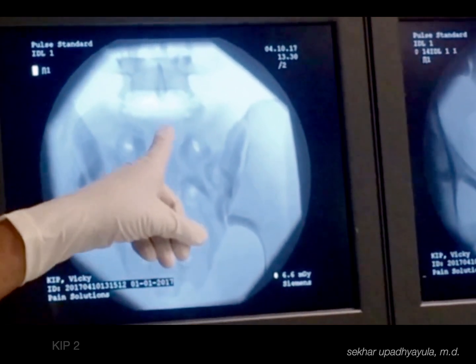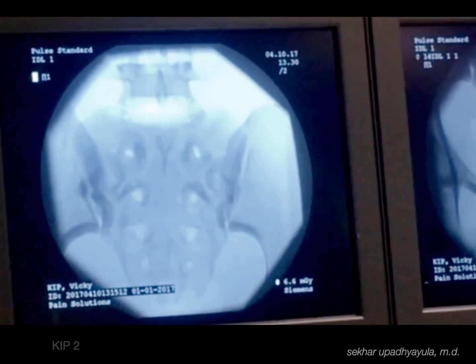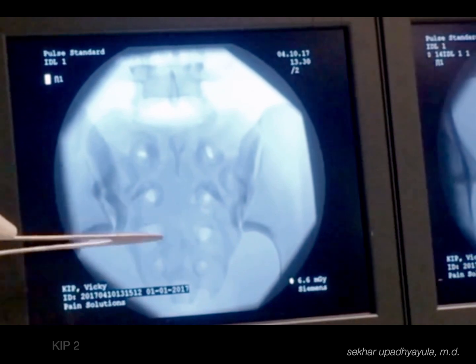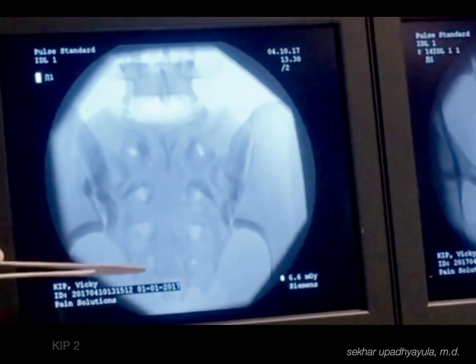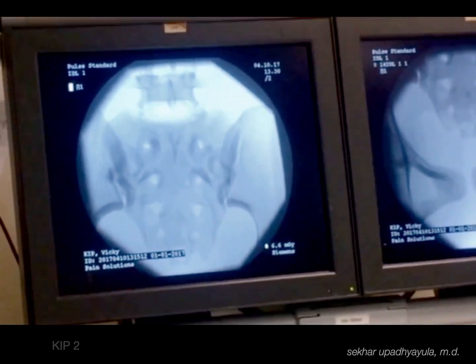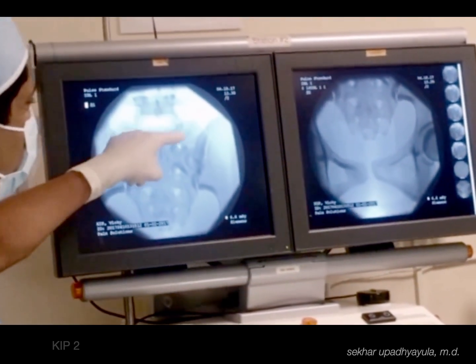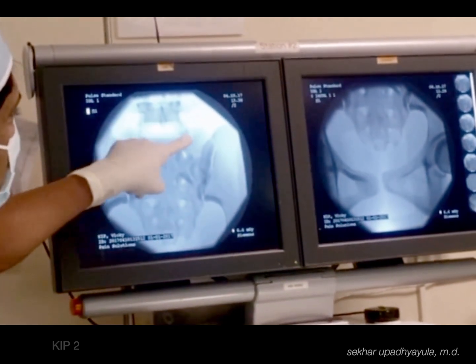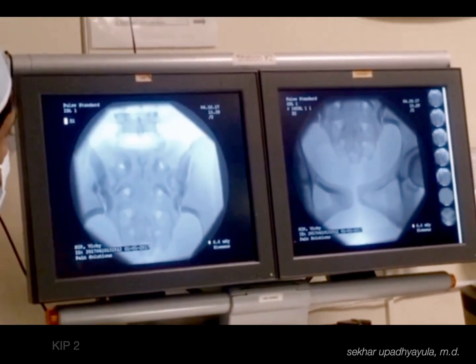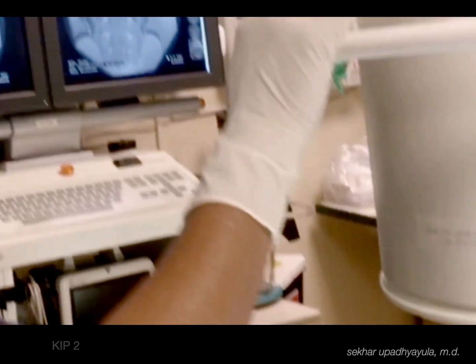We can see the posterior spinous processes back in the sacrum. We can see what I would surmise is S1, 2, 3, 4, and 5 would really be way down here, but often you don't see S5, or certainly you don't need to treat that. And here I can see the interspace of the L5 and the S1. The S1 is up here, but it's fused. The 5 sacral units are fused. Let's move up again, please.